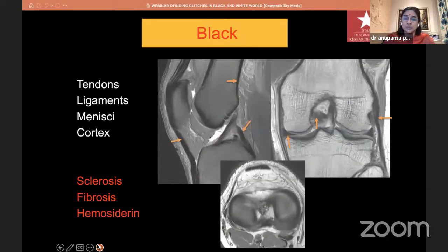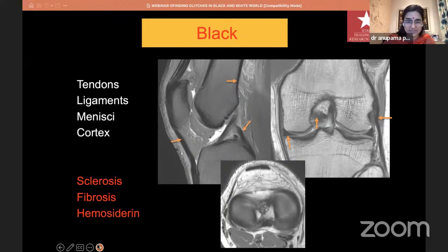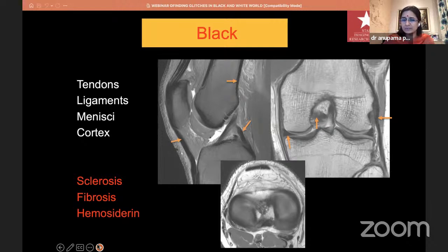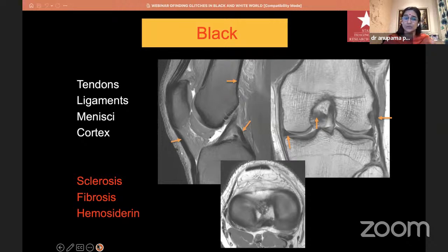Since Neha told me to make this black, white, and gray: most things are black on MRI on all pulse sequences — tendons, ligaments, menisci, and the cortex are black. Any signal in any of these structures means we're looking at some pathology. The exception is if you have sclerosis, fibrosis, and hemosiderin — these also tend to be black. Just two things which are gray: articular cartilage and red marrow. The things that are white are anything with fluid and anything with fat — fat pads and fatty marrow will be white. Most pathology is white: degeneration, edema, and injury will all appear white.